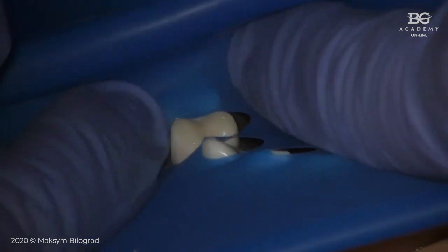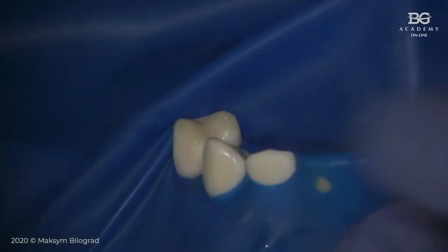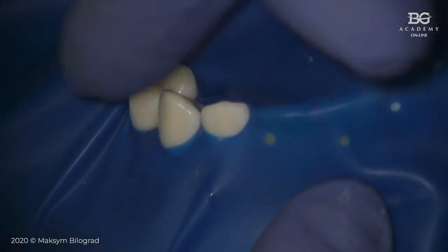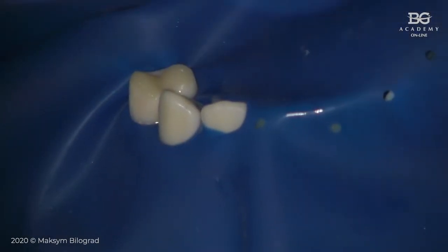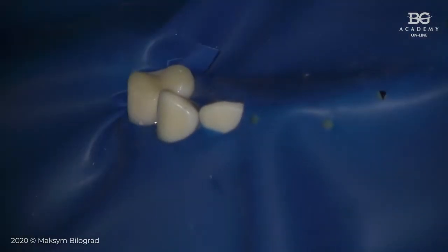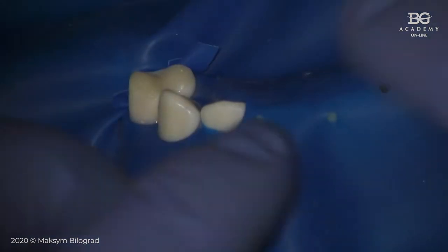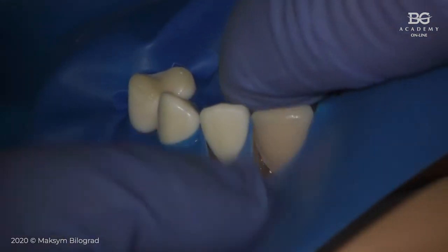Okay, I will not go in details now. I will just go between teeth here, between canine and premolar. And then before I continue opening other teeth, I will have to stabilize my rubber dam here on that part. You can put a clamp, or if you have, for example, a pretty tight interproximal contact, you can just take a piece of rubber dam like this, rubber dam cord we call it, and you put it between teeth like this. So you will stabilize your rubber dam and the rubber dam will not jump out, and you can continue moving your rubber dam between the rest of these teeth.